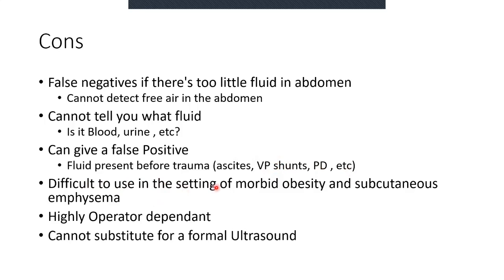It's difficult to use in the setting of morbid obesity. So the more obese your patient is, the more adipose that ultrasound beam has to go through. And remember that ultrasound beam is being physically impeded by that adipose as well, right? The other thing is bowel gas, similar thing. So the more bowel gas, the more obese. These are not good patients to ultrasound. The good part with bowel gas is that if you just keep pressure, bowel gas tends to dissipate. If you keep pressure on fat, it doesn't dissipate. Otherwise, all of us would be absolutely thin. So unfortunately, it doesn't work.